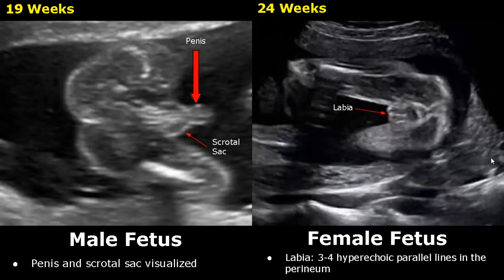At 24 weeks, the appearance of the labia is even more clear. We can see the hyperechoic parallel lines very clearly. Determining the gender becomes easier as the fetus grows.